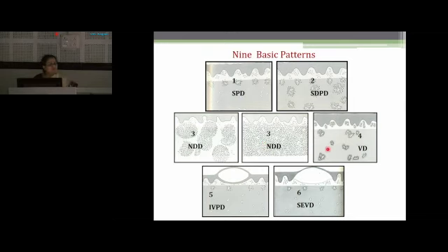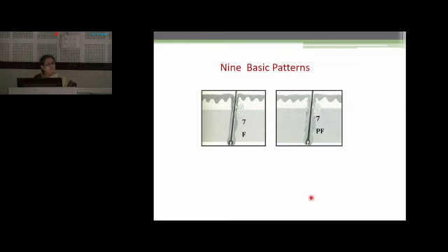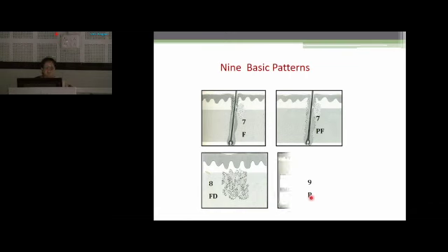The fourth pattern is vasculopathic dermatitis. It is limited to those lesions which show changes in the vessel wall, mainly disruption of the vessel wall and presence of fibrinoid necrosis also. The fifth and sixth patterns are for separation or cleavage type of dermatitis. Depending on the level, they are further subdivided. The next pattern, the seventh pattern, is folliculitis and perifolliculitis. So inflammation is seen in and around the hair follicle.